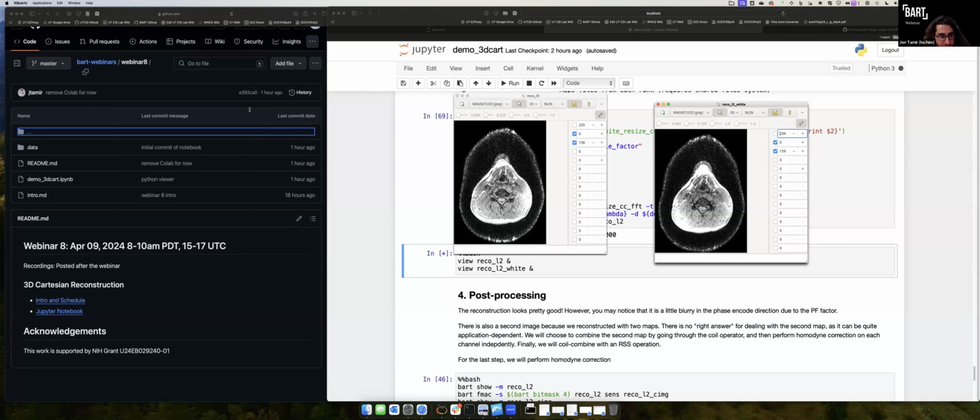You can estimate sensitivity maps that differ for each phase, and that could give you a slight improvement. It kind of depends if you're seeing problems in the first place with what you're doing. But it is common, if you assume that the object itself is not changing too much and the coil loading isn't too different because of the heart beating, that the sensitivity maps are relatively consistent so that it's okay. So whether it is a problem really depends on if you're seeing a problem.